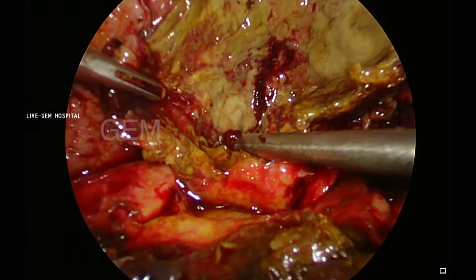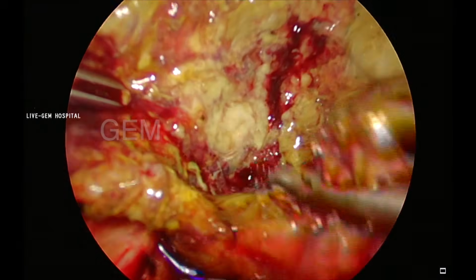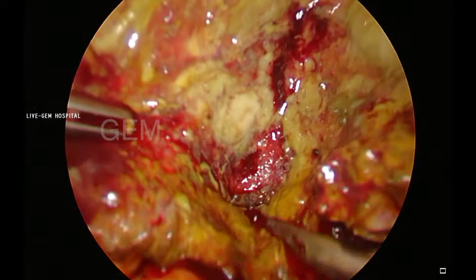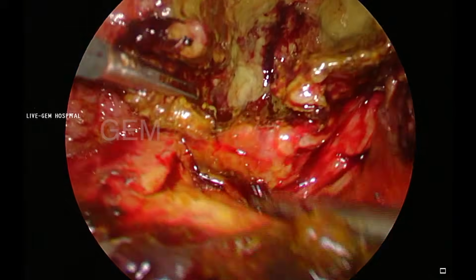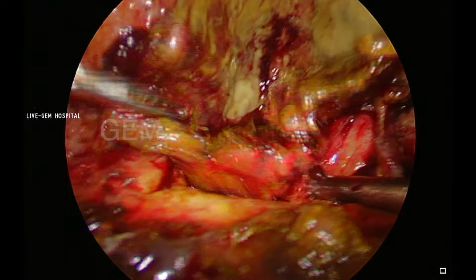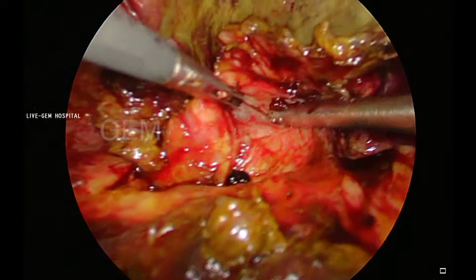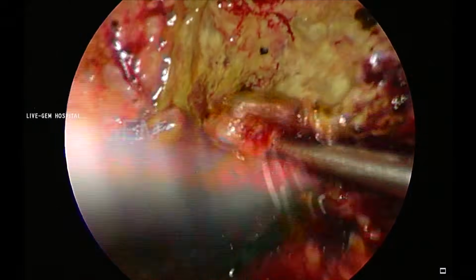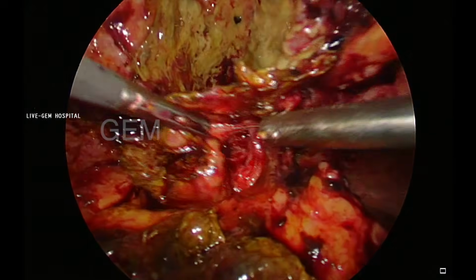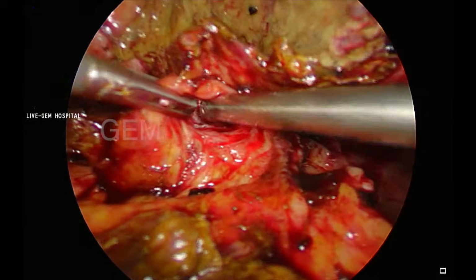That area has become frozen. The infundibulum, cystic duct and CBD junction is frozen here. If I want to go for definitive clipping, then I may injure the CBD. So that is also not good. So I'm just trying to separate. That is the CBD. You can see it well. The suction nozzle is touching the CBD. So there is no place to apply a clip here.